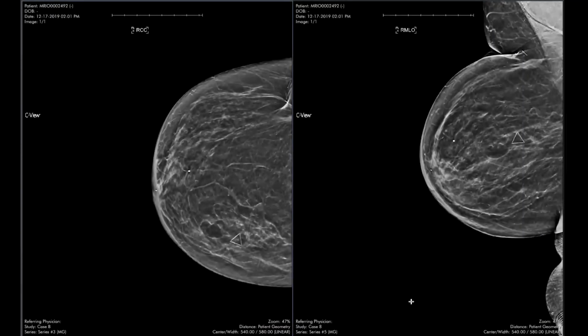The BI-RADS Atlas describes 3 specific findings on mammogram and 3 specific findings on ultrasound, which they say are appropriate to give a BI-RADS 3 assessment based on evidence-based studies. But they also state that radiologists can use the BI-RADS 3 category based on their own experience. One example of this is post-trauma.